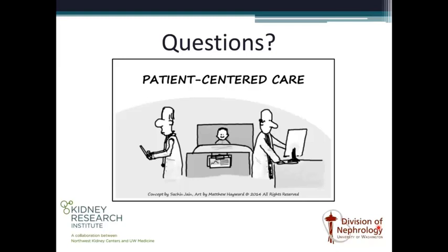Yeah, so I guess your second question, I don't think that we should just sit back, because I think there is enough observational data that to me is compelling that for certain patients, we should do this. And for all of us who see patients with resistant hypertension as secondary referrals, I do think it can be really valuable to establish a baseline and then assess response to treatment because of, as I've mentioned, the very high prevalence of white coat and masked effects in these patients.